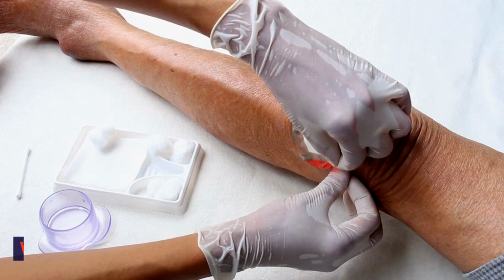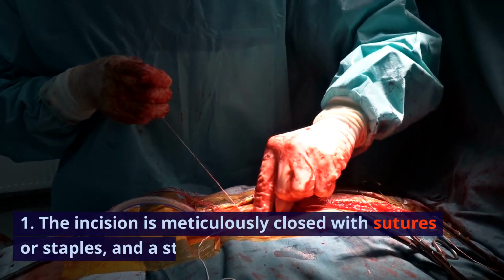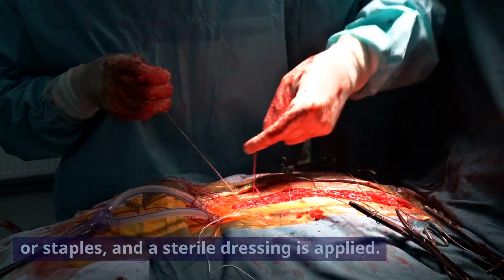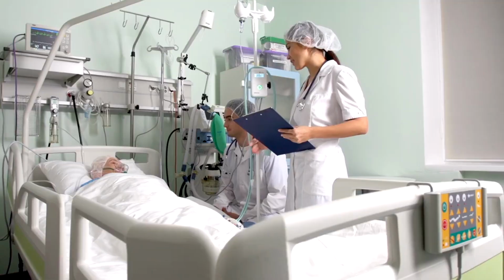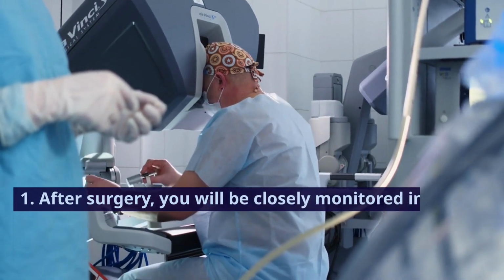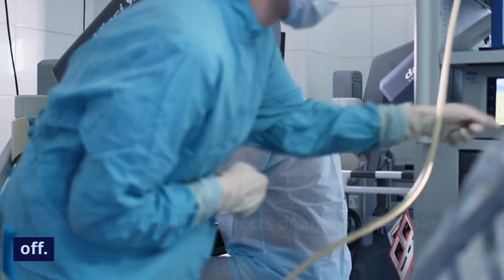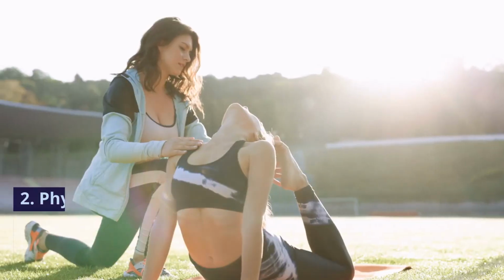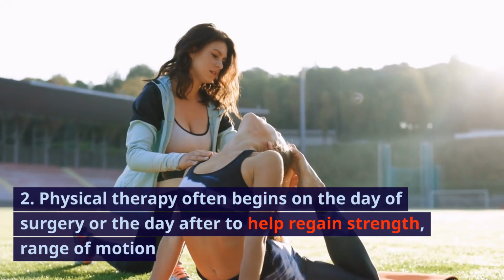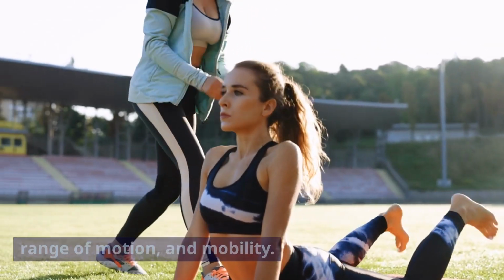Wound closure. The incision is meticulously closed with sutures or staples, and a sterile dressing is applied. Postoperative care. After surgery, you will be closely monitored in a recovery area until the effects of anesthesia wear off. Physical therapy often begins on the day of surgery or the day after to help regain strength, range of motion, and mobility.